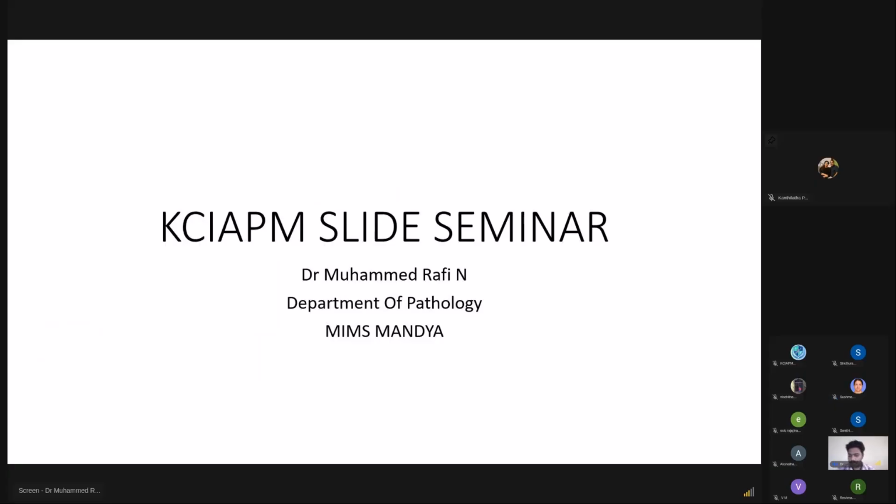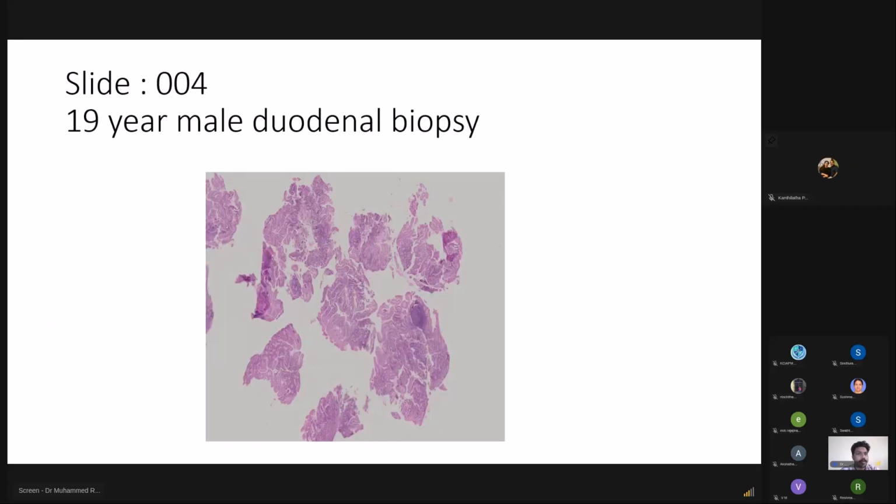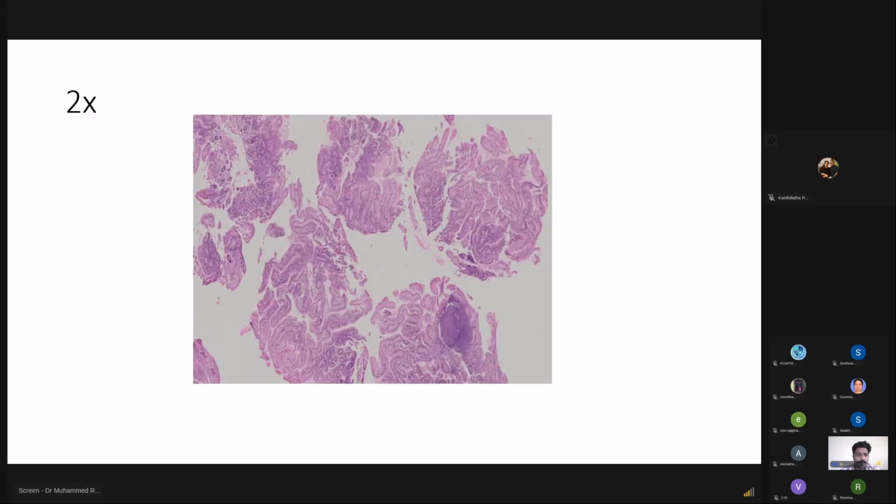Good afternoon, everyone. Myself, Dr. Mohammad Rafi from Department of Pathology, MIMS Mandya. I am allotted spot number 4, 19-year male duodenal biopsy. This is the slide view. We can see here the picture. This is a 2x view.